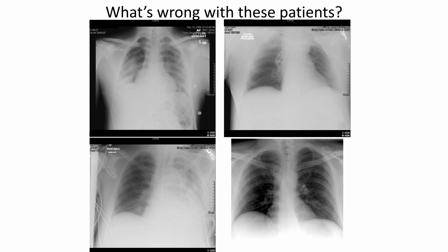But you can see post-op here, if you look over at his right lung, there's actually something wrong with his lung. You can look around the edge and see that the top edge of the lung is kind of near the sternum. So this is a collapsed lung on the right side. Somehow he had a collapsed lung on the opposite side where his arm was torn off, and that can happen when you tear any sort of tissue in the pleural space, and you can also see a lot of atelectasis in the base of the lung. It's the darker white tissue.